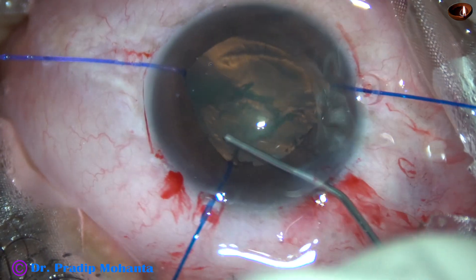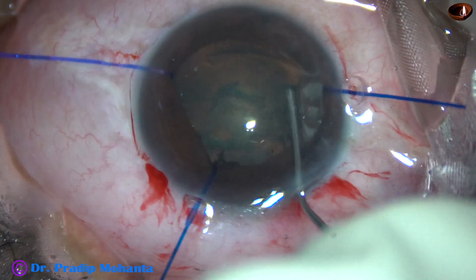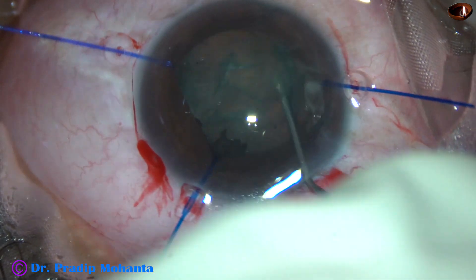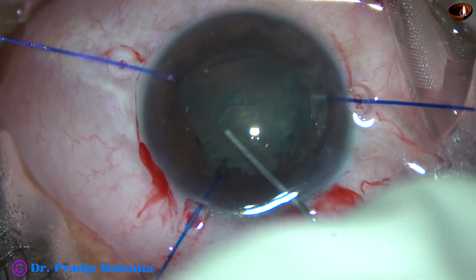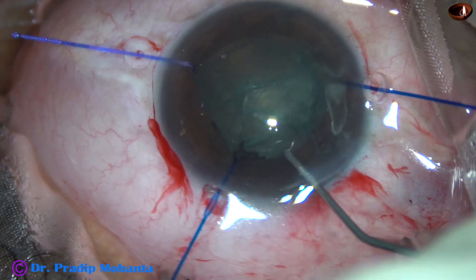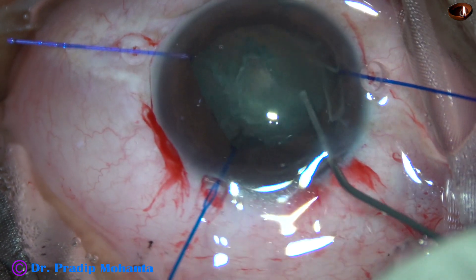Hydrodissection is done gently and I try to rotate the lens mass. I could rotate it only a few clock hours, then it gets stuck. However, the hydrodissection has been okay.